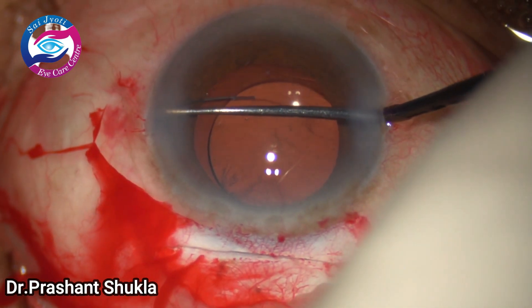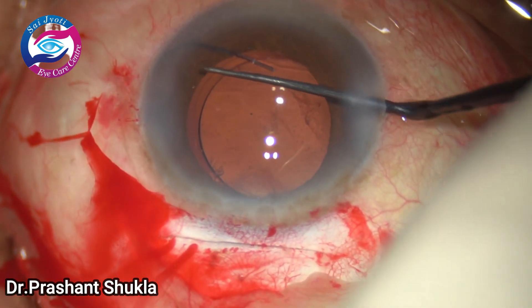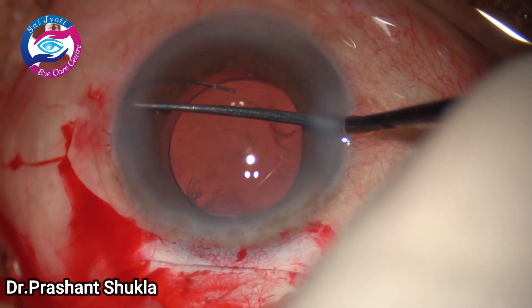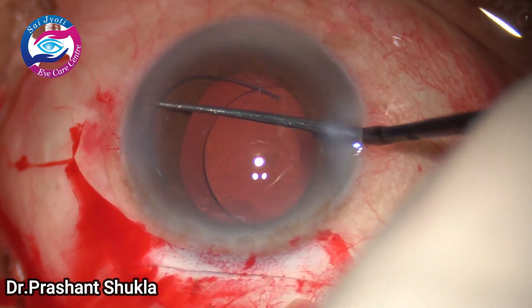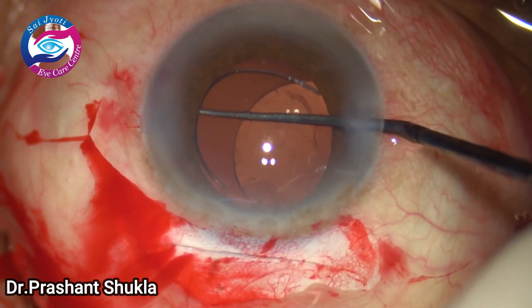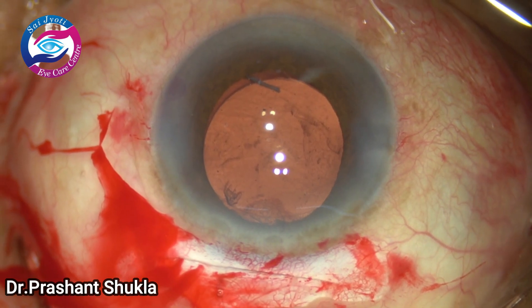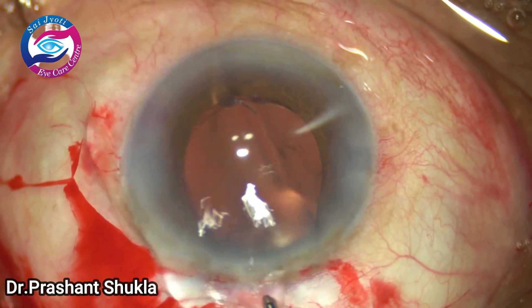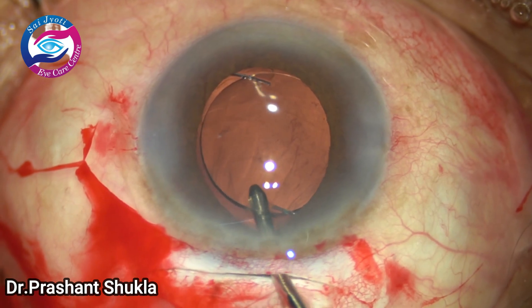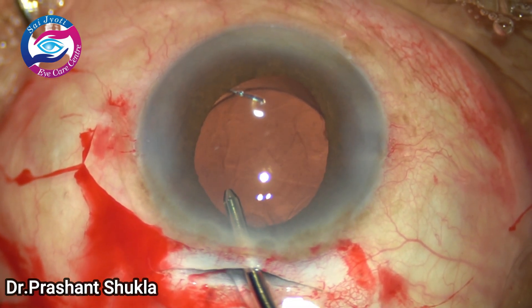I am now planning to just hold the haptic and use a technique of bending the haptic to place it into the capsular bag. Here it goes — and at this moment I inadvertently caused an iridodialysis, or a small peripheral iridectomy, with resultant bleeding, which one can see at around 5 o'clock. Using the irrigating jet one can see blood coming out through the inadvertent iridodialysis.